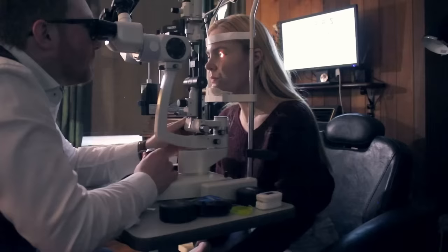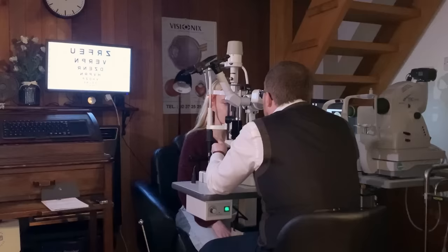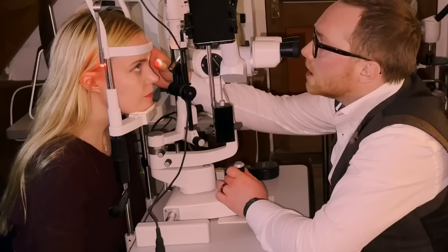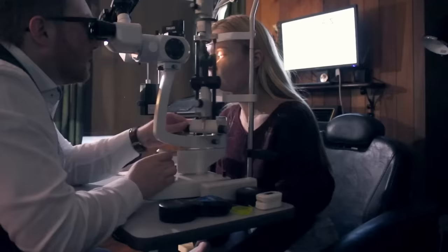And have a look at your other eye. And looking over to your left. And over to your right. Straight up at the ceiling for me. And again, I'm just going to gently lower this eyelid. Very good. And looking down. Okay. And again, looking straight ahead for me. And if I get you to blink and just stare for as long as you can.